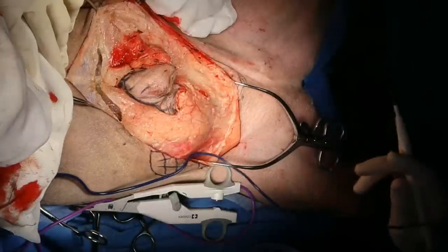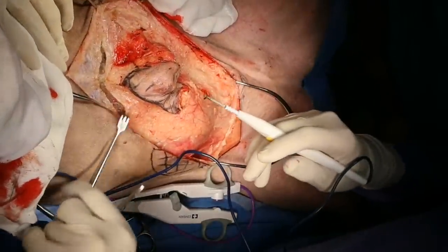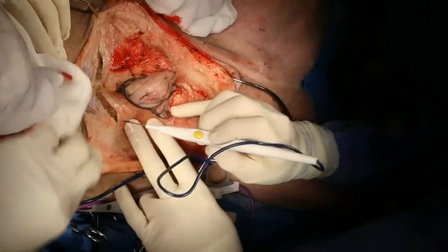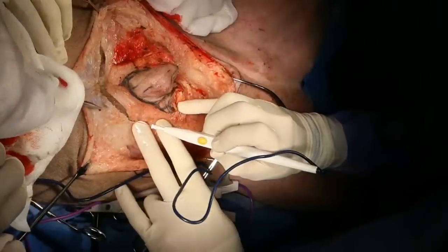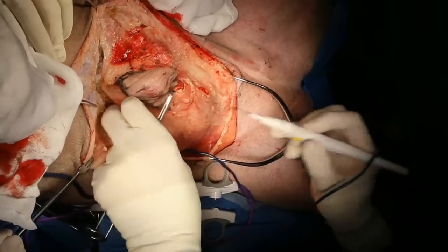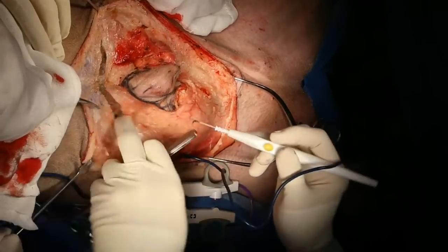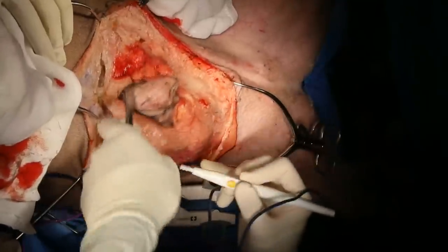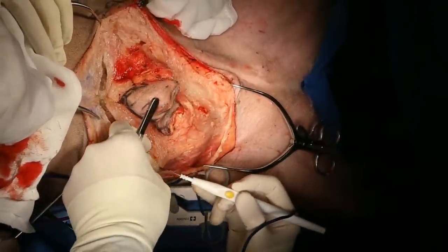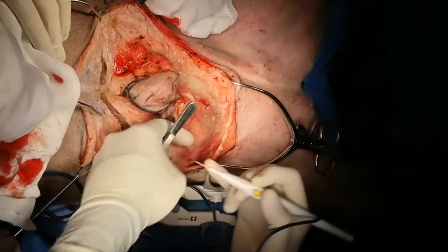Uday, do you want to come around this side? Yeah. And there really isn't a lot of justification to really try to conserve abdominal wall because we're going to likely have to use a polypropylene mesh anyway. And it doesn't really matter within reason how big a mesh you use.